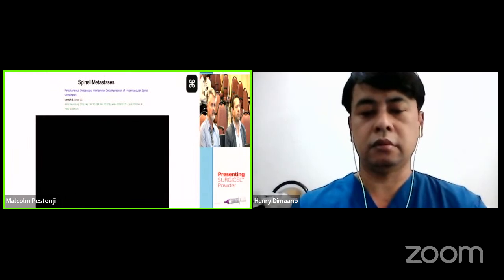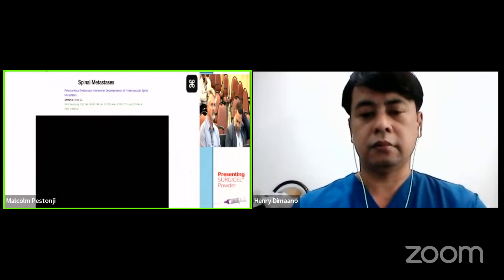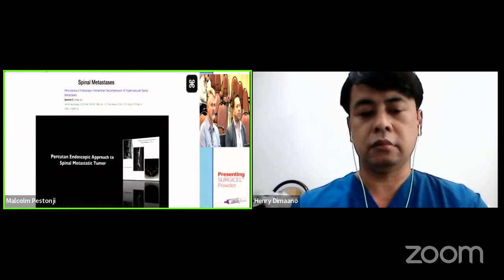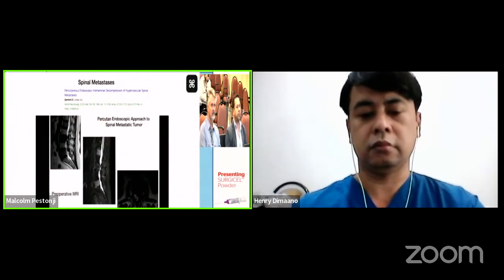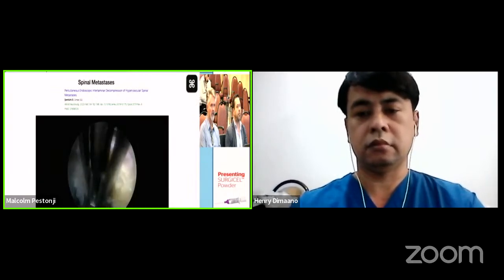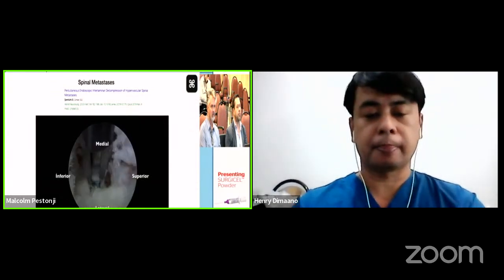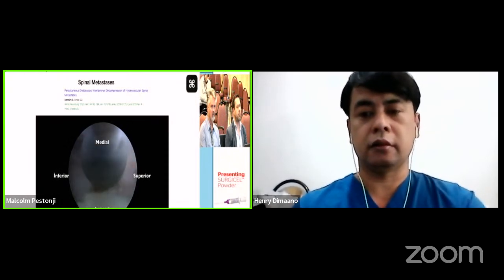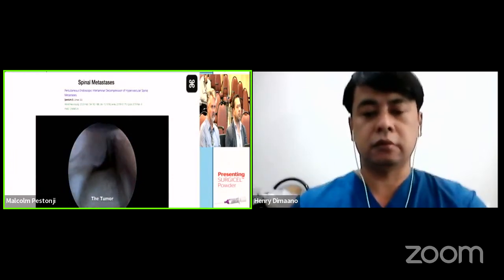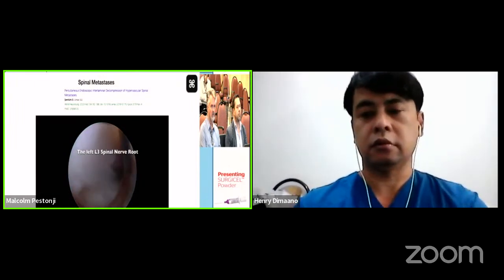Spinal metastasis is another endoscopic option for this type of pathology. You may see this case. The patient has severe left leg pain. For this type of pathology, you have to embolize the tumor. If you get a hypervascular spinal metastasis, we embolize the tumor before we perform surgery. Here is tumor tissue. If you embolize the tumor, you can perform this surgery easily, like disc surgery.